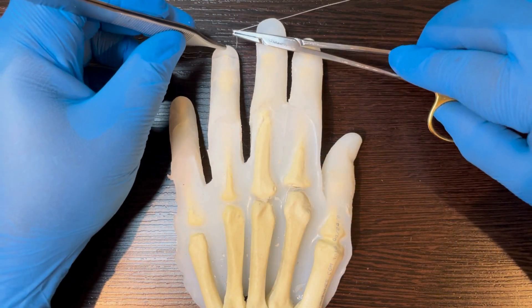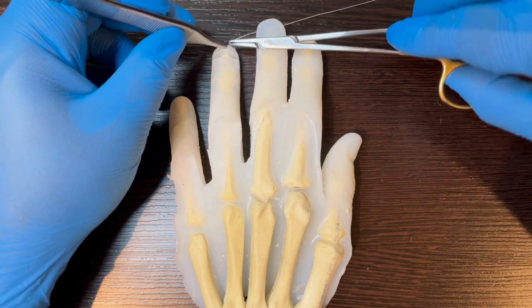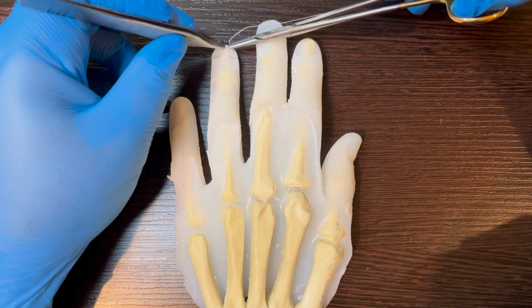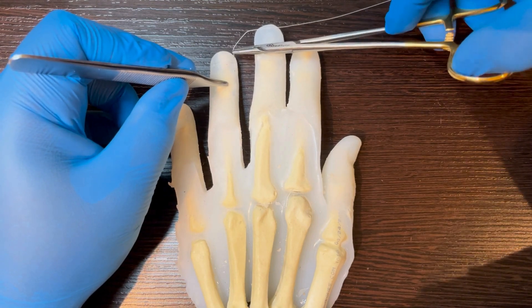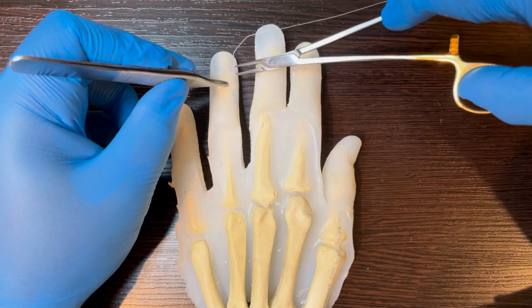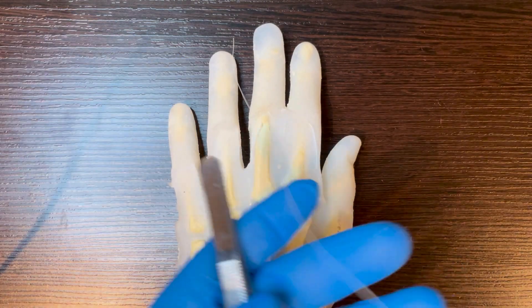You start by suturing the pulp and perinychial folds for alignment. The next tip is essential to being a pro at these: suture from island to shore, from unstable to stable. In this case, from the tip of the finger to the proximal finger.